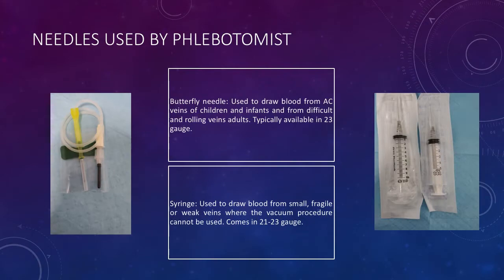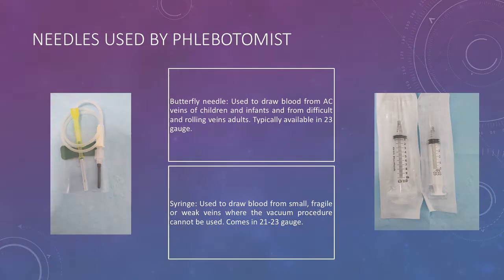Phlebotomy needles are sterile, disposable, and designed for a single use only. They include multi-sample needles, hypodermic needles, and wing infusion needles, well known as butterfly needles, used with both the evacuated tube system and the syringe system. Multi-sample needles are commonly enclosed in a twist-off shield or cover. Hypodermic needles and butterfly needles are typically sealed in pull-apart packages.